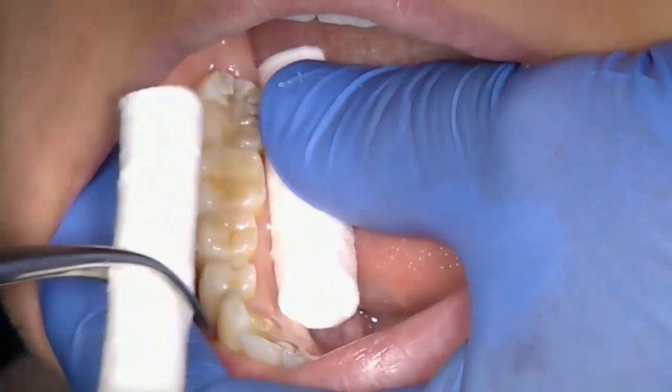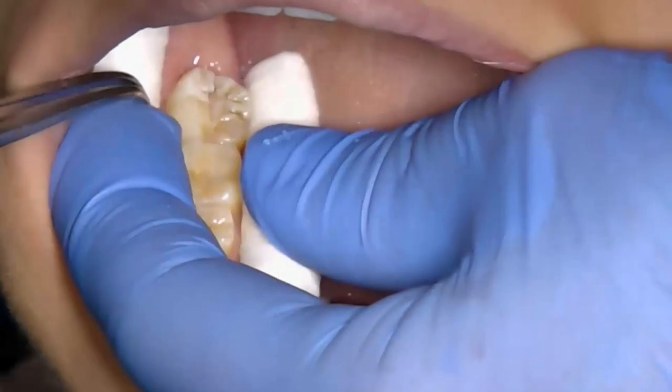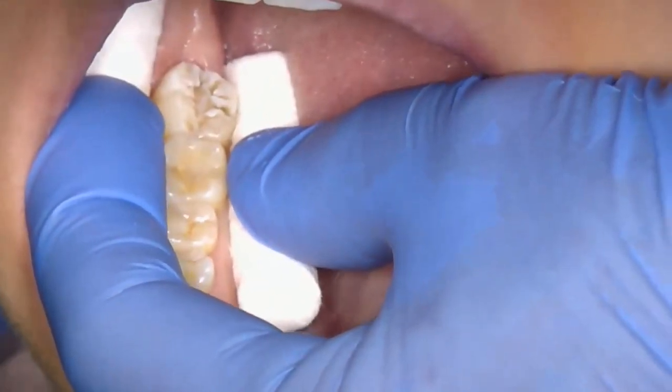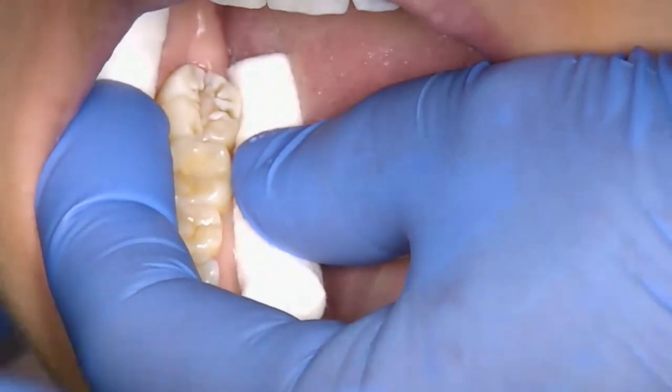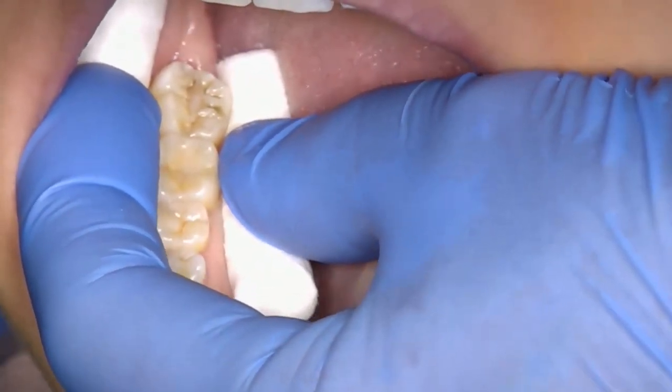Once the cotton wool rolls are placed correctly and the tooth is isolated, dry the tooth with the 3-in-1 syringe. Using a micro brush that has been well wetted with the bond, apply the bond to the tooth fissures. Very gently blow some air using the 3-in-1 to remove the excess solvent and disperse the bond.